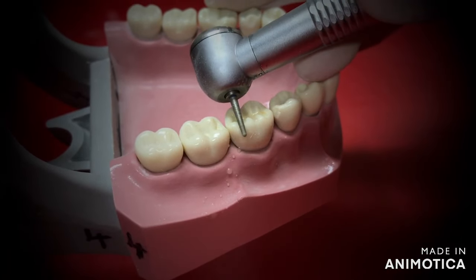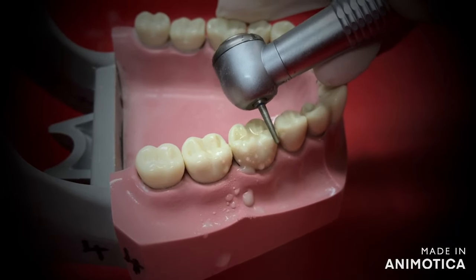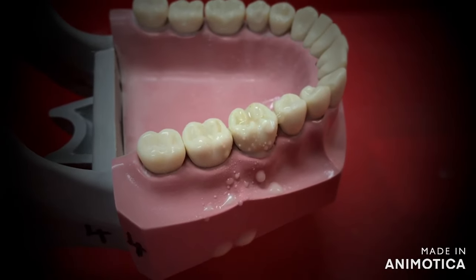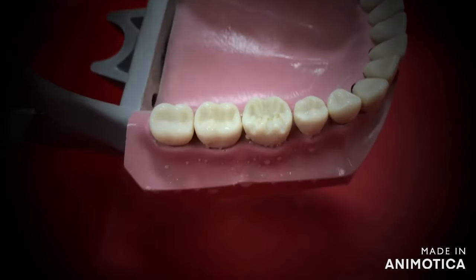You will then make the grooves for the functional cusp bevel. Angle your burr almost 45 degrees to the buccal occlusal surface or the line angle and sink the burr in the same three points.